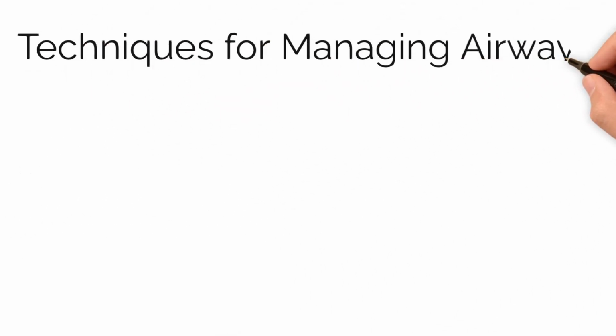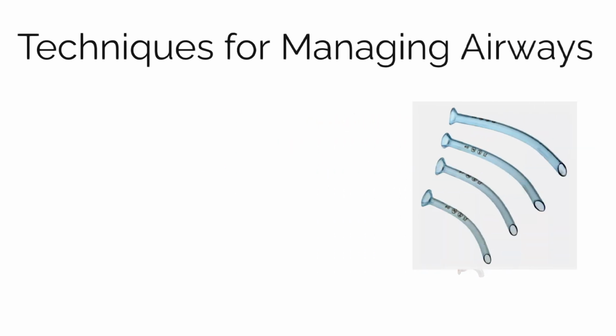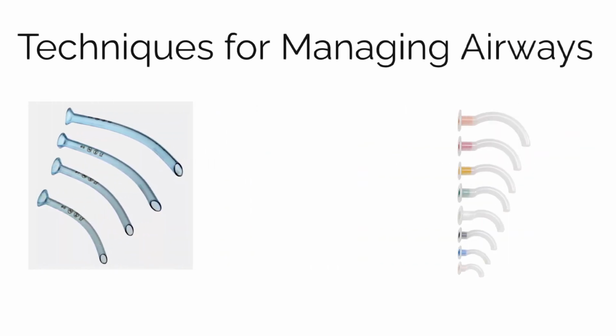In this video, I'll be covering essential basic airway management techniques, focusing on simple maneuvers and the use of airway adjuncts. Just a quick reminder, this content is for educational purposes only, so always check and follow any local protocols and procedures. So, let's get started.